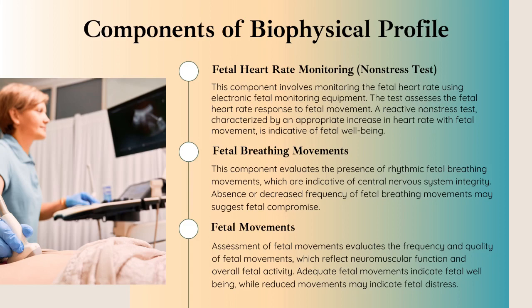Fetal heart rate monitoring, which is known as a non-stress test. This component involves monitoring the fetal heart rate using electronic fetal monitoring equipment. The test assesses the fetal heart rate response to fetal movement. A reactive non-stress test, characterized by an appropriate increase in heart rate with fetal movement, is indicative of fetal well-being.